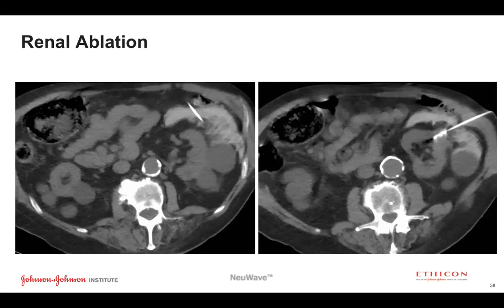Another reason why this is less than optimal, if possible, is any chance I get to avoid poking the tumor directly, I will take it. And that's because lesions don't have normal blood vessels. They don't have the same structure to their blood vessels. Their blood vessels are more friable, more fragile, and potential bleeding risk is higher.